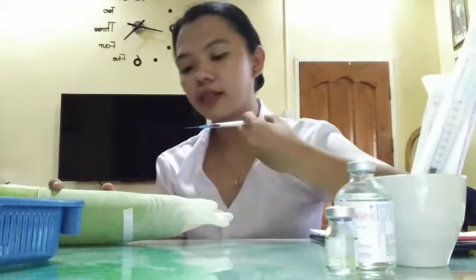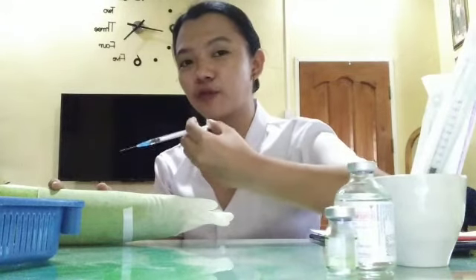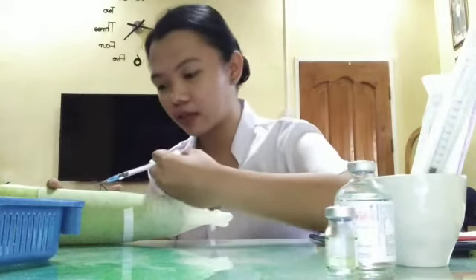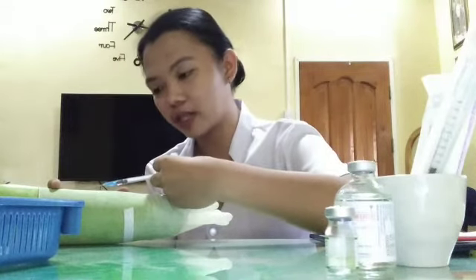Make sure that the bevel is facing upward, and the angle must be 5 or 15 degrees, so it is parallel to the hand of the patient.